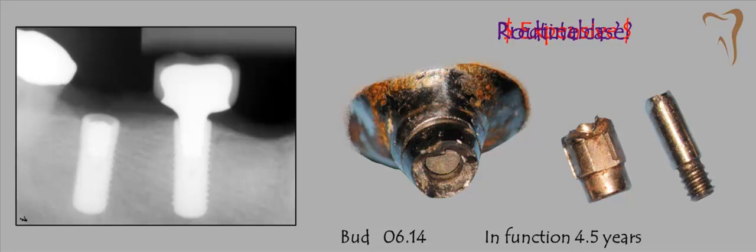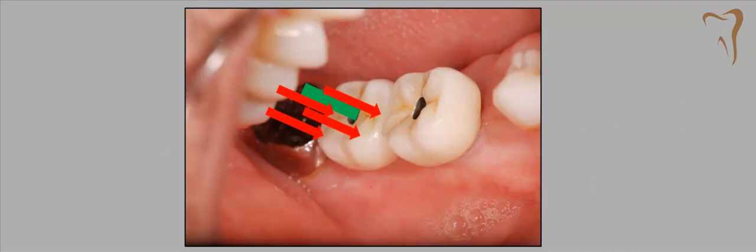It costs more money because someone's going to have to pay for Bud, because Bud's probably listening to the radio and he's heard that just a few implants in one arch can solve his problems and he doesn't have to go back to the dentist anymore. So what happened here? Well, the axial loads on this, right down the middle, right through the screw axis, everything was placed well.